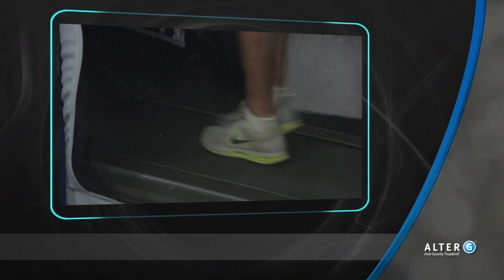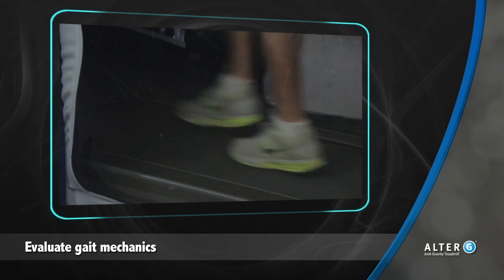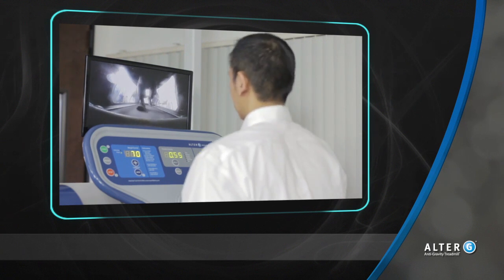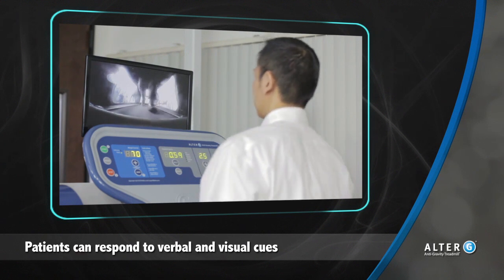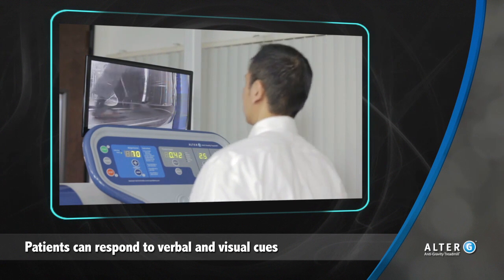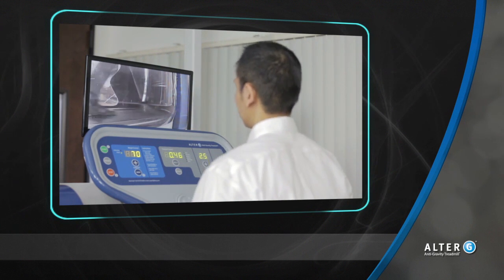Objective evaluations can be made from the rear and the side to assess frontal and sagittal plane mechanics. With the Alter-G video monitoring system, an additional front view is possible with the internal camera. Having the ability to see their own mechanics is a great way for patients to respond to verbal cues from the therapist to improve their gait mechanics.